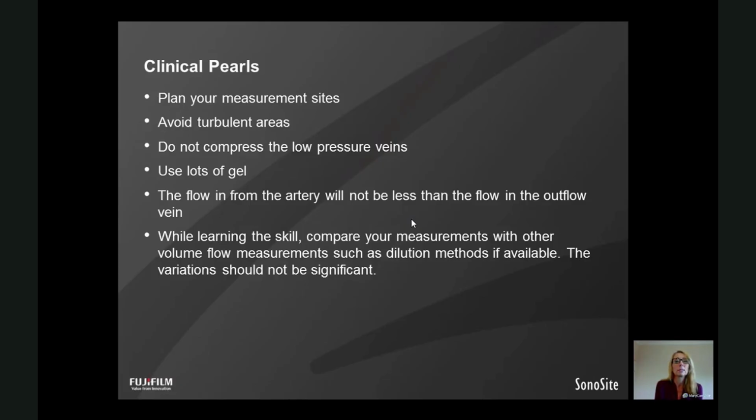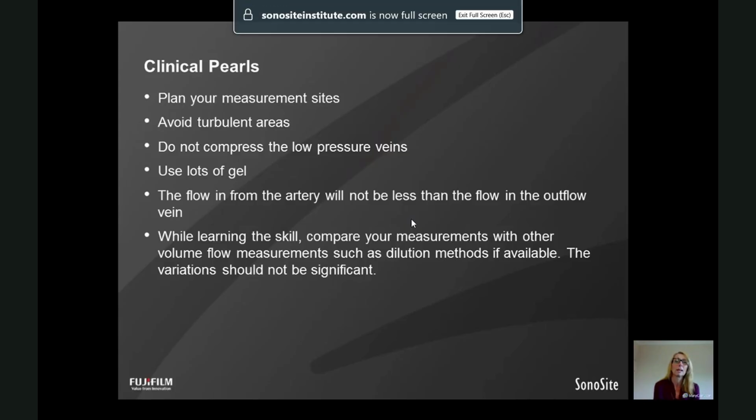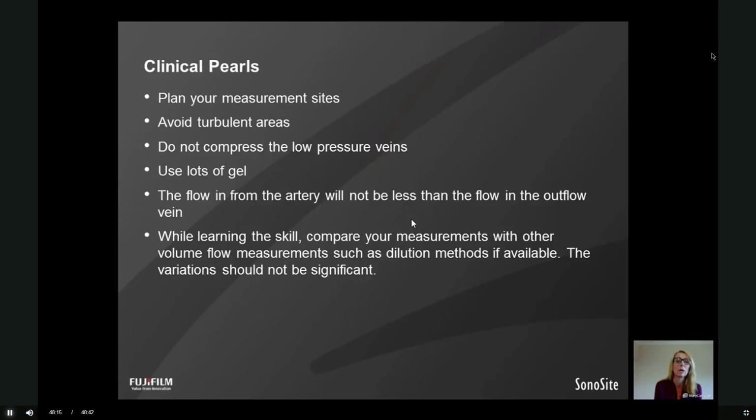And then when the people are on dialysis, so that you're not interfering with their dialysis time, I put them on dialysis with their needles in, and then if it's possible, I do ultrasound measurements of their brachial artery, so that I can still get in and do that even though the needles are in, they're not in the way, and I can do the brachial artery measurements without making them wait to start on dialysis.